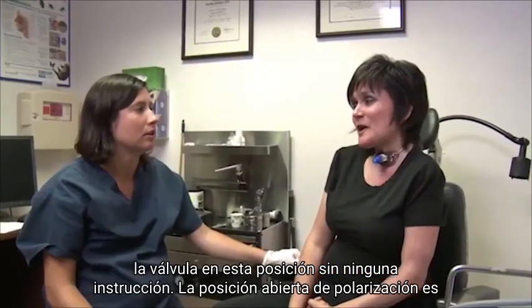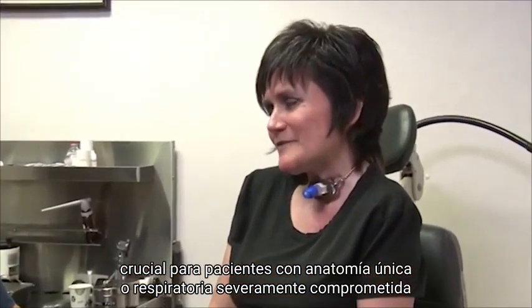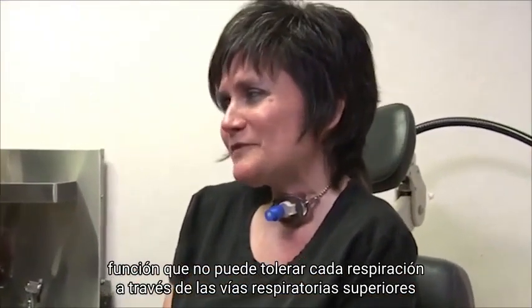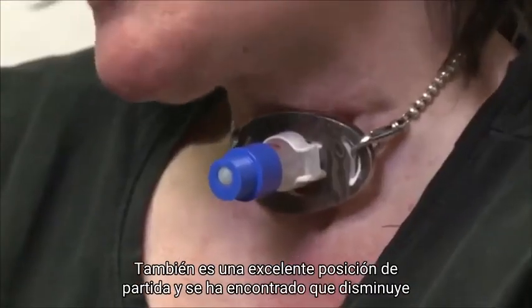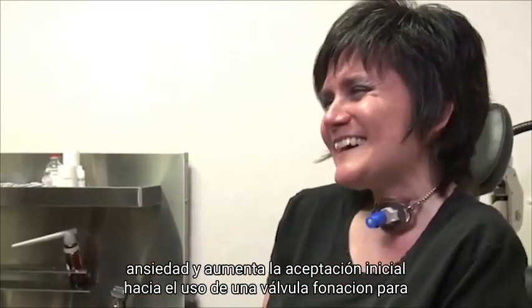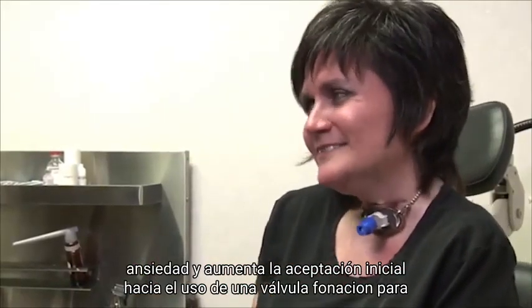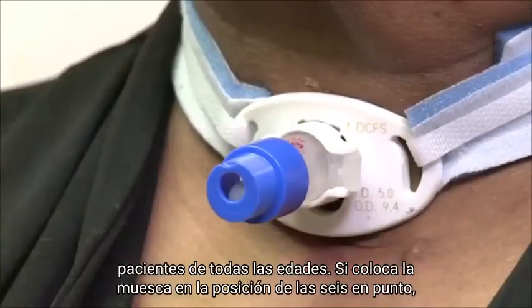The bias open position is crucial for patients with unique anatomy or severely compromised respiratory function who cannot tolerate every single breath through the upper airway. It is also an excellent starting position and has been found to decrease anxiety and increase initial acceptance towards wearing a speaking valve for patients of all ages.